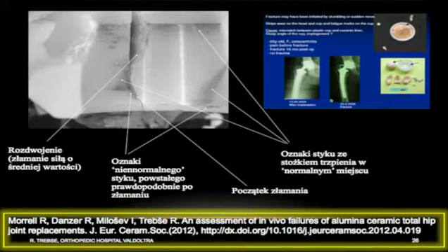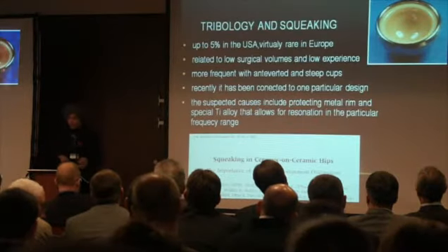Nevertheless, in the last 5 years, we follow 500 plus patients with the composite ceramics right now, and with the same surgeons and the same patient and the same hospital, we haven't seen a fracture in this series, and we follow our patients 100% since they don't have anywhere to go.